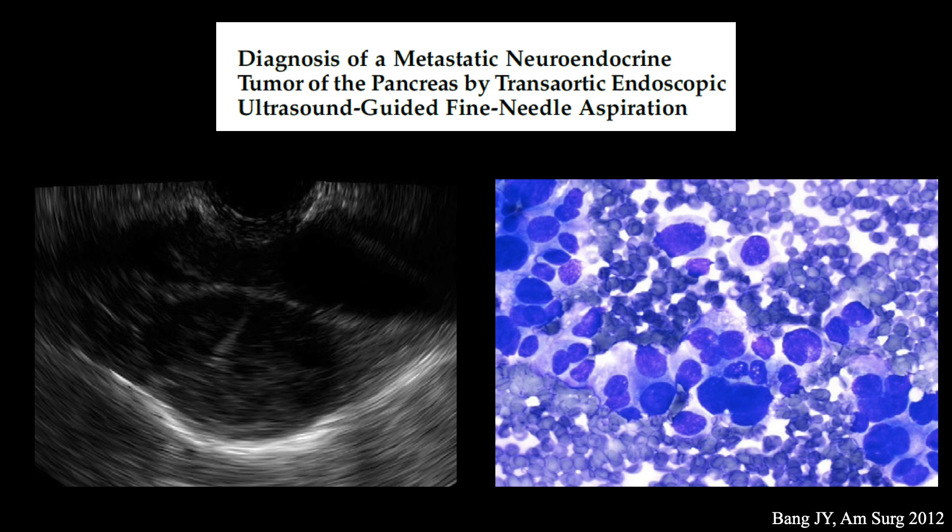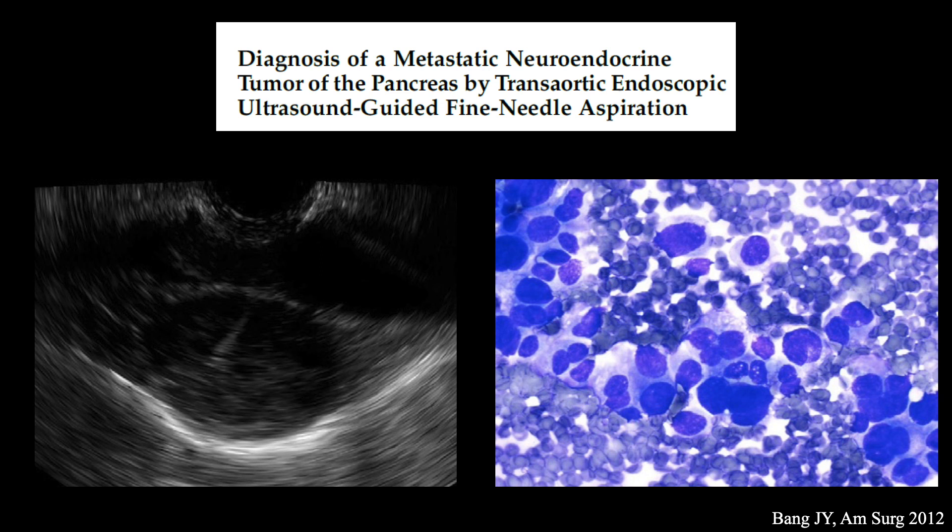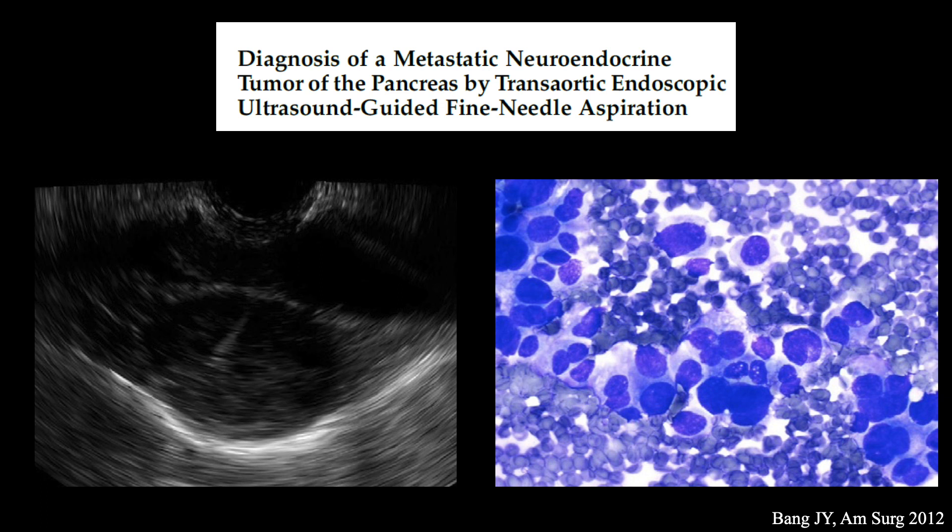In a prior report from 10 years ago, we reported on the safe performance of trans-aortic FNA via the esophagus in a patient with suspected tumor in the posterior mediastinum, which was proven to be a metastatic neuroendocrine tumor. However, successful outcomes are strongly reliant on following the checklist outlined earlier.